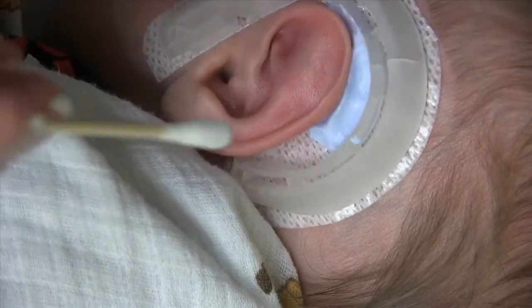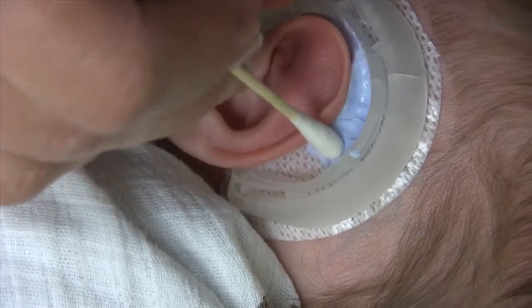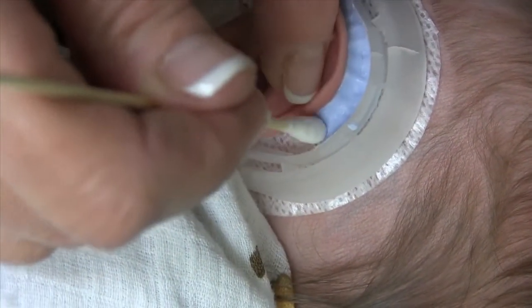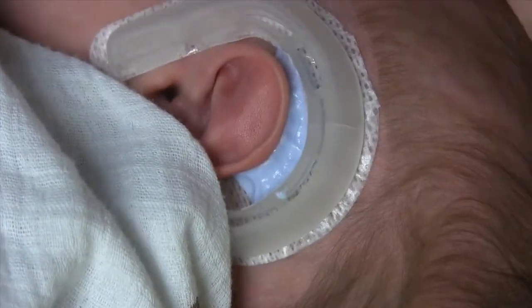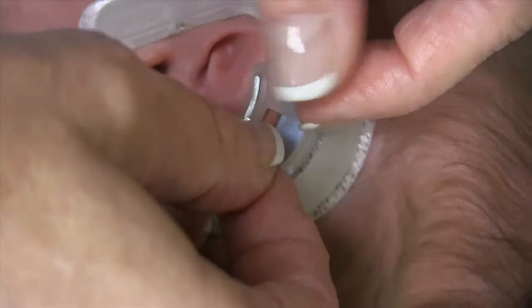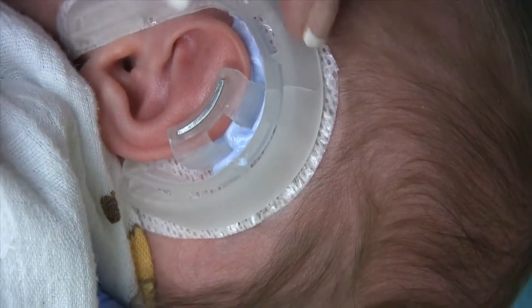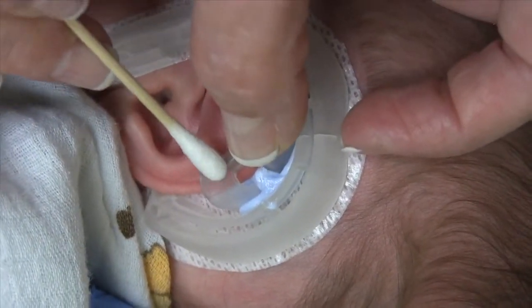I'm kind of curling this up around the rim and building this up, and that's going to allow us to get that curvature at the top and give that support from behind. I'm feeling this is starting to get a little bit harder. Once it hardens, it forms memory, and that will allow it to stay in place even after it's dried. We'll now go ahead and add our retractor in — see how that allows us to curl that without making a sharp edge, and this will just hold the foot plate in place.